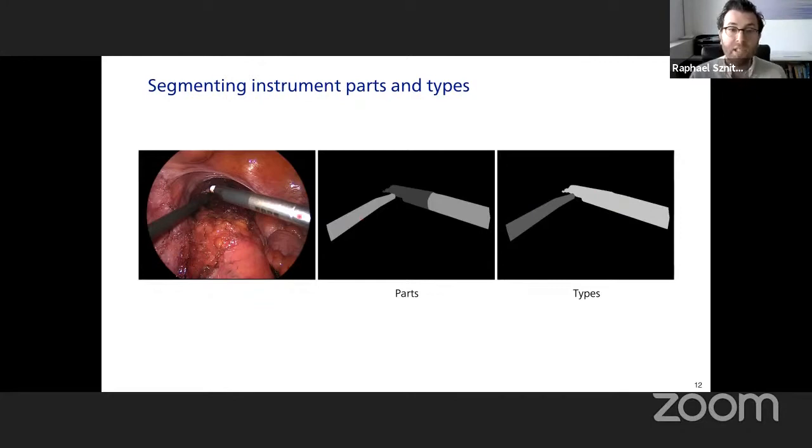So what distinguishes these two instruments isn't the shaft, it's this tiny bit at the very end, right? And that's what allows you to ultimately make this judgment. So context, as you can imagine, plays a critical role in being able to make proper decisions.